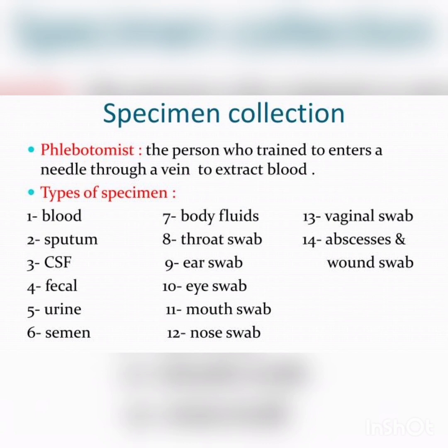You all might have seen how they collect the specimen for corona diagnosis. There is a stick with a cotton tip, and they insert that stick into your nose or mouth and collect the specimen from the nasopharynx or oropharynx. Then they keep it in a test tube containing a solution and send it to the laboratory for the particular study, RT-PCR. The rapid antigen test they do on the spot. Within 5 minutes you will get a report. So that is different.